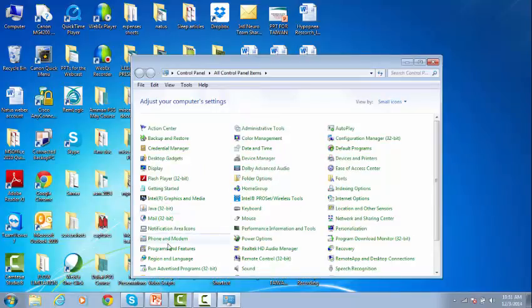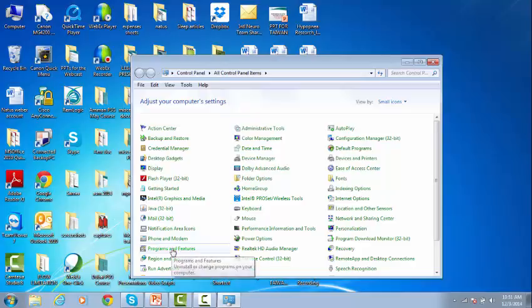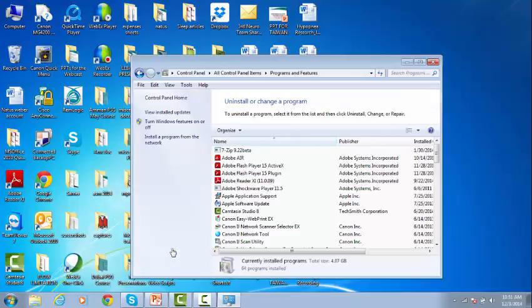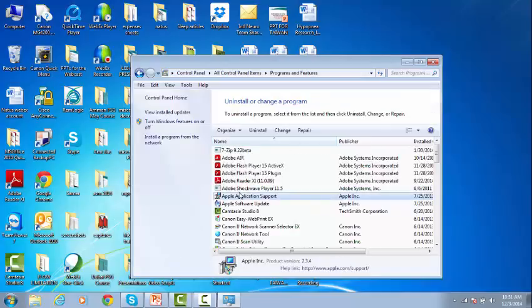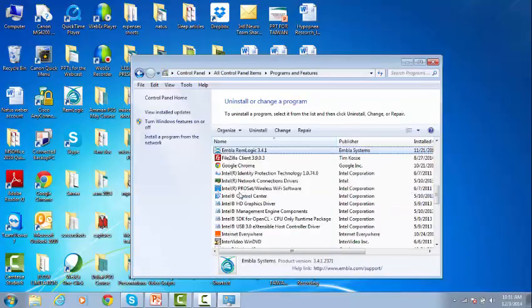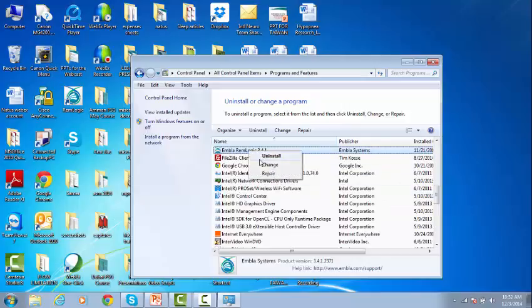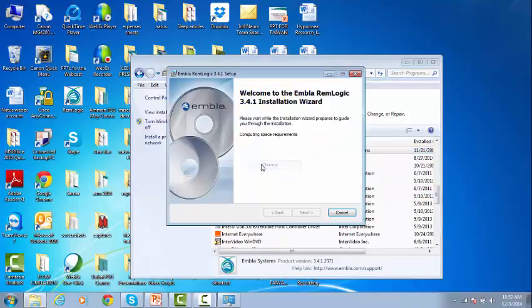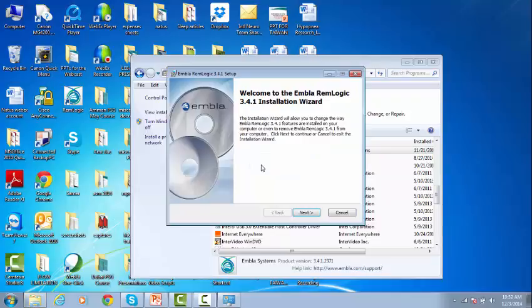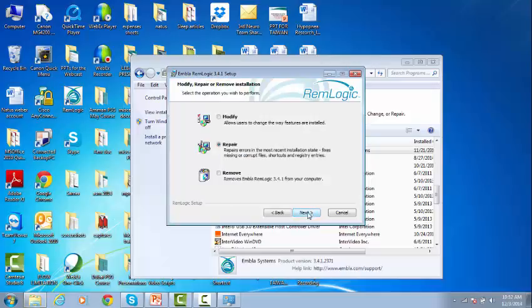Then go to Programs and Features, go to RimLogic, right-click on it, and select Change. The setup window will pop up. Read and follow the instructions. Click Next.